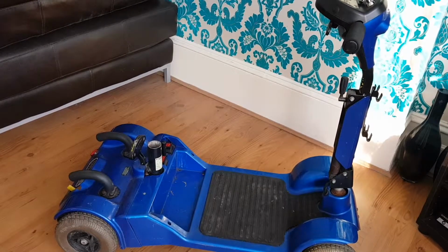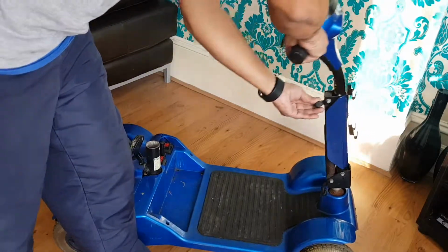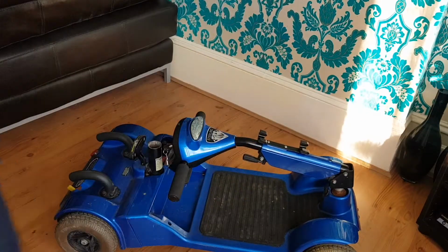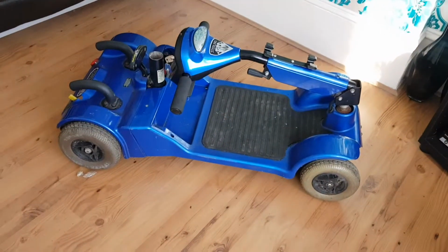What else? Handlebar, so we can adjust this from here. If we look, you can just fold this down. You can adjust it to your height, but if you want, you can just fold it down like that. So now it's all down there. Just move the camera down a bit so you guys can see.